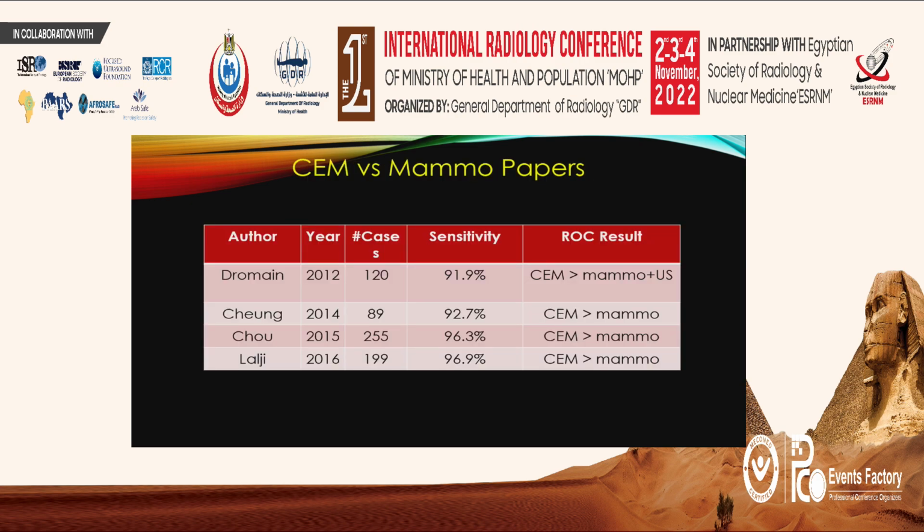So here's the table summarizing 4 early papers comparing contrast mammography to standard mammography, and as expected, contrast mammography was superior to standard mammography in all of them, with sensitivities in the low to mid 90s.